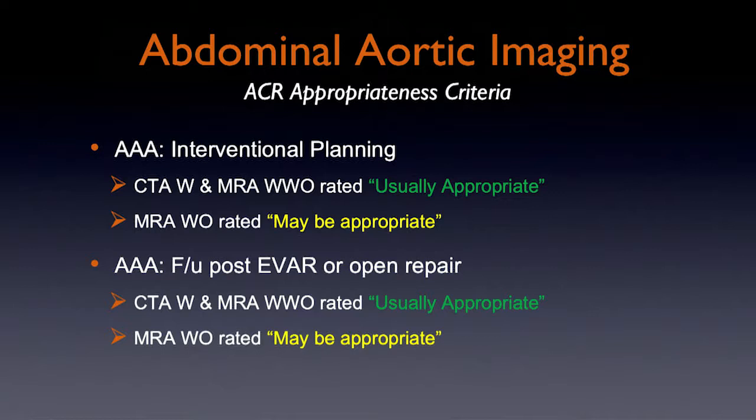And then even after follow-up, so after they've had repair, either open or EVAR, following them up to see if there's any complications from that, assessing the size of the sac. Similarly, CTA and MRA are rated similarly appropriate.